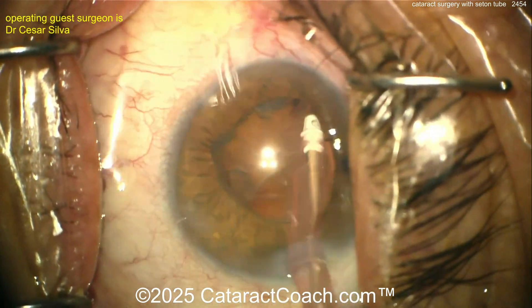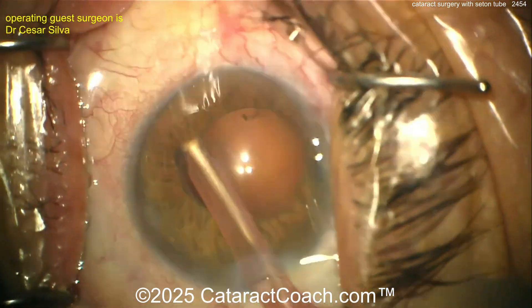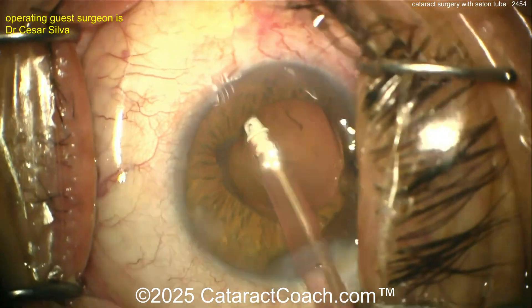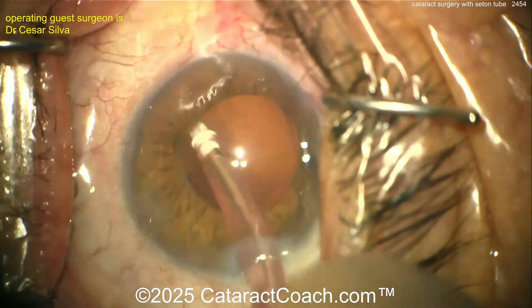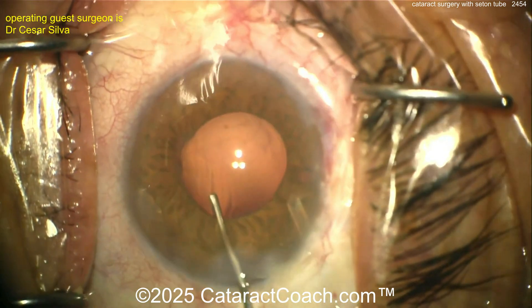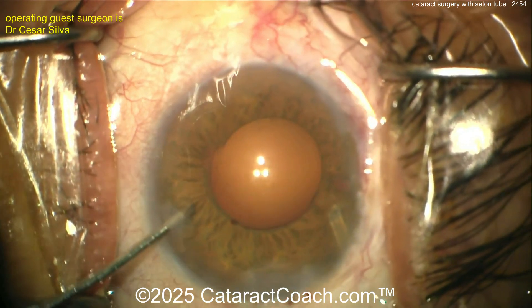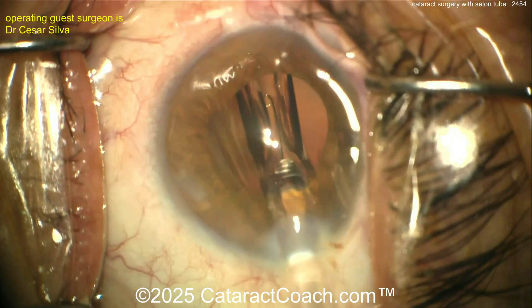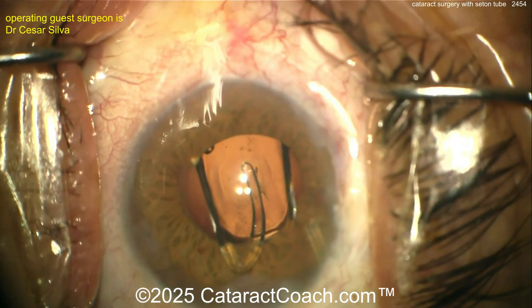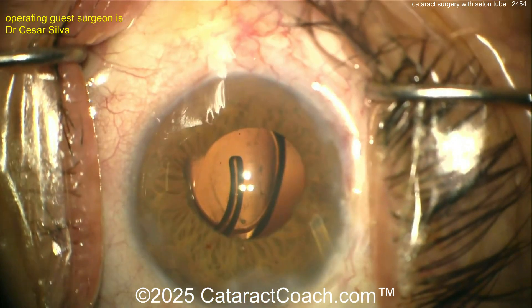Once you see those trypan blue particles, increase the IOP by hydrating inside the anterior chamber with BSS. Once the IOP goes up, you can see the trypan blue particles flow out into that tube and into the subconjunctival/sub-Tenon's space. That's what you want to verify. Here at the end of the case, getting the IOL in the bag, I like to do that trypan blue outflow verification just to be sure.